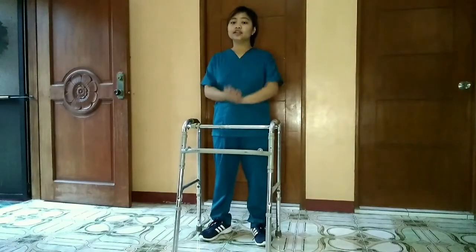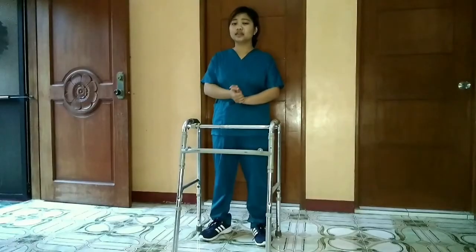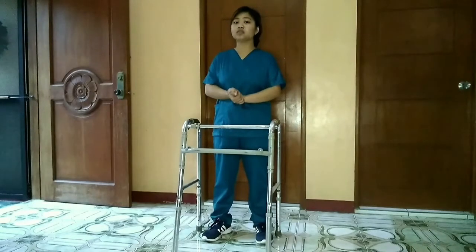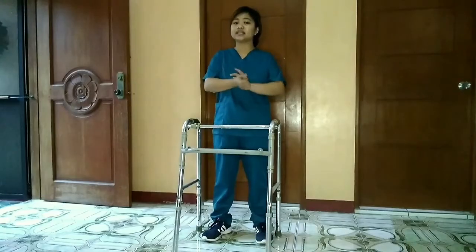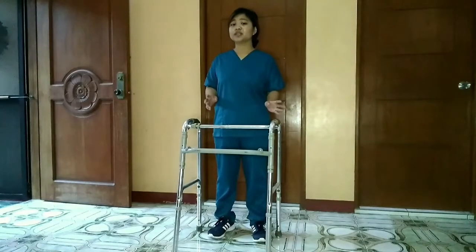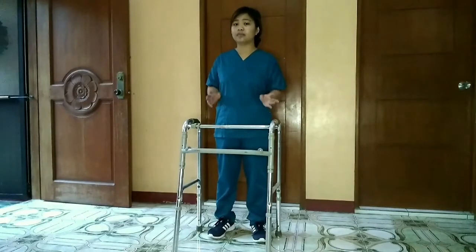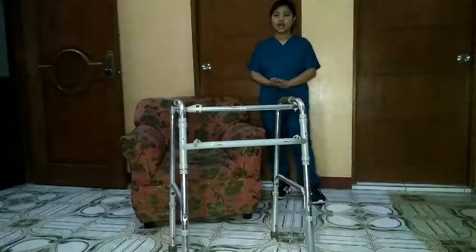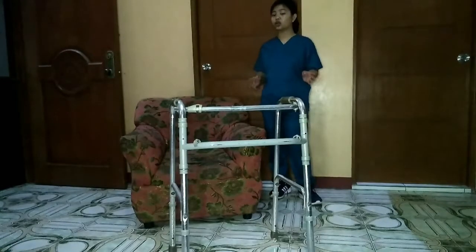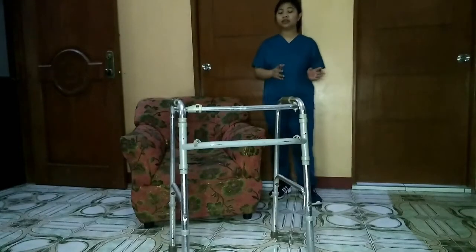And then the nurse must instruct the patient not to advance past the front of the walker. Also, the patient must be instructed on how to advance if weakness is present. And lastly, the patient must be instructed not to climb unless the walker is designed for steps. And don't forget to assist your patient to a comfortable position in bed or in a chair.